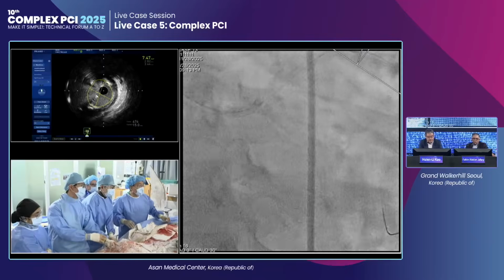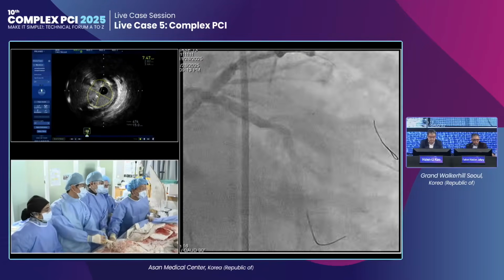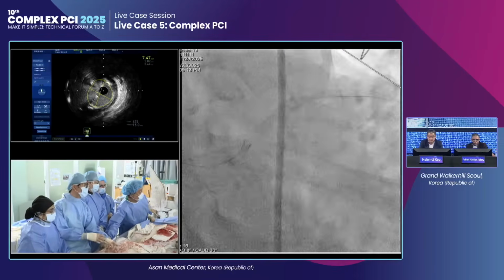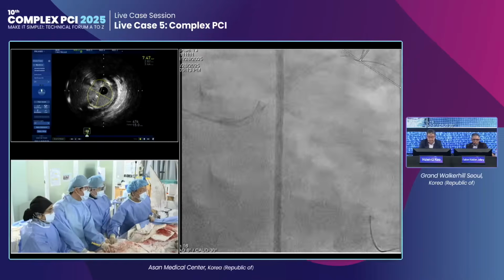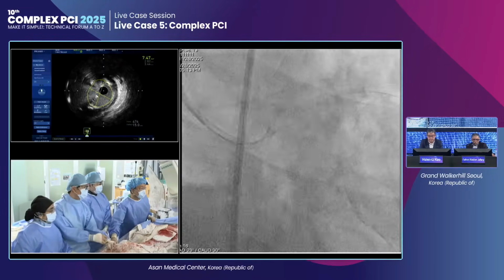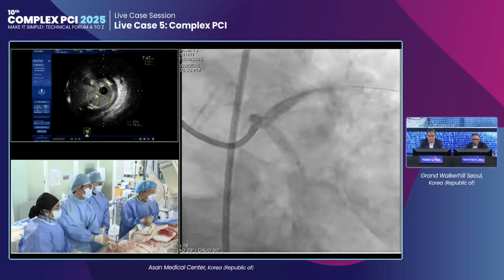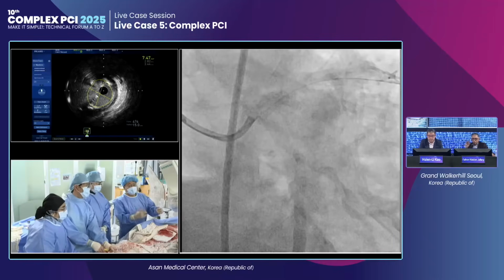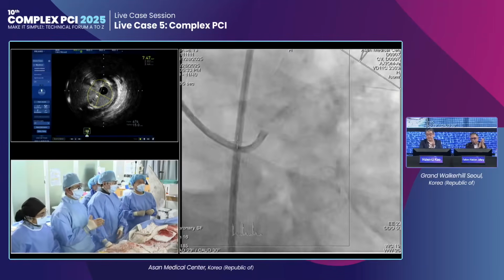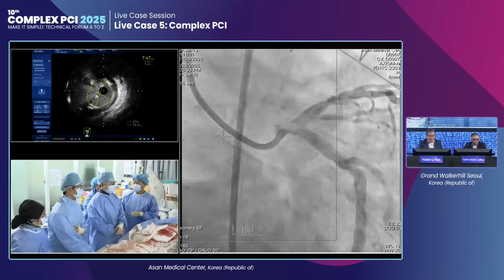I think this is such an educational case. It was a good idea not to dilate. I think it was a good idea. This is really a good teaching case, and I think it's very important. Take a picture here. This picture is very good. Excellent case.